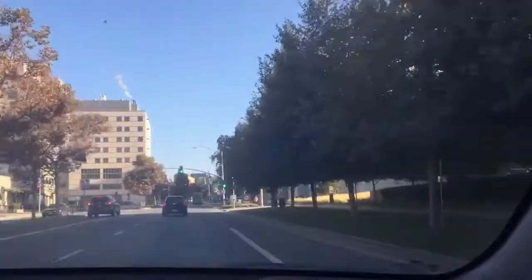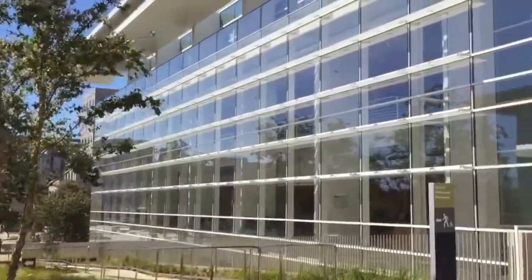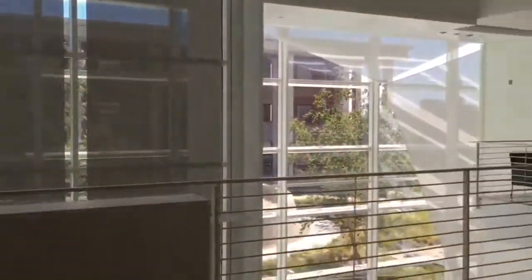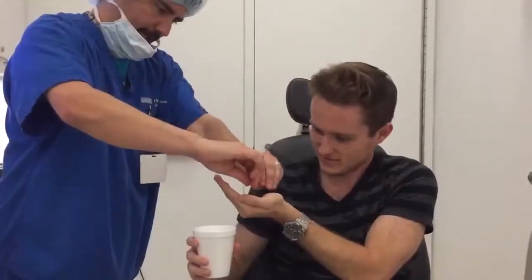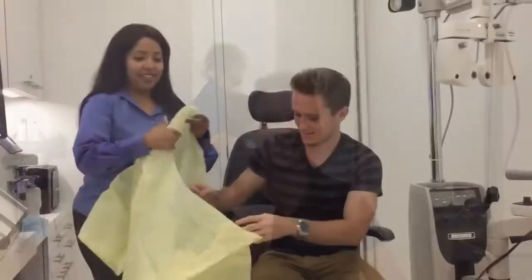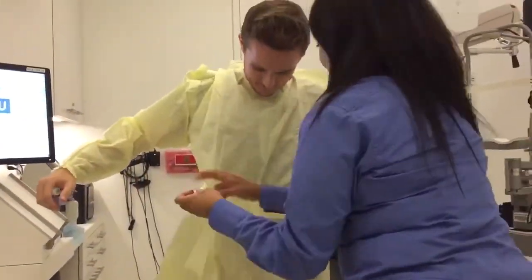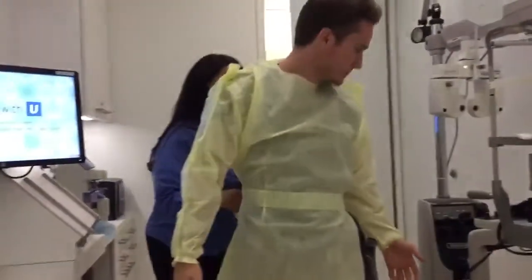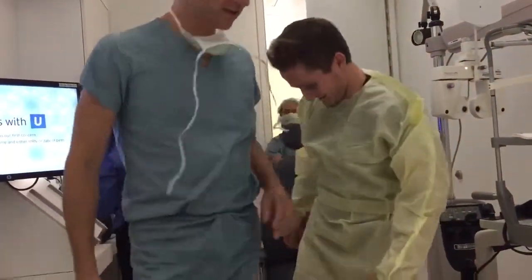Let's get started. Come back in and get the rest of it going. Okay, perfect. All right. Yellow is your color.